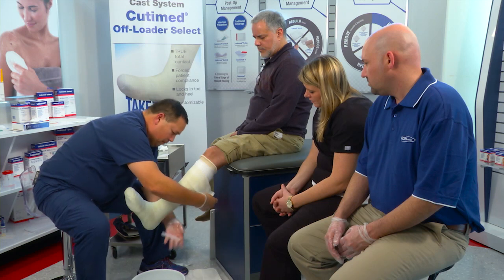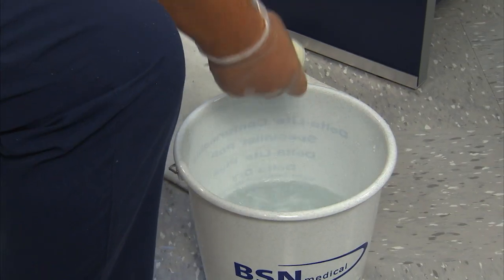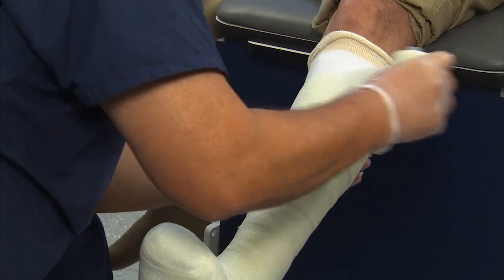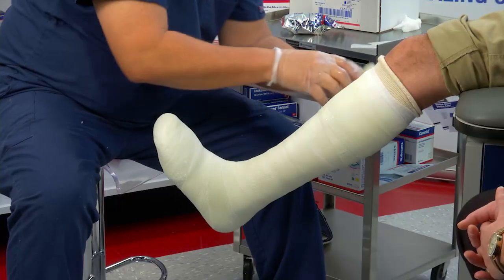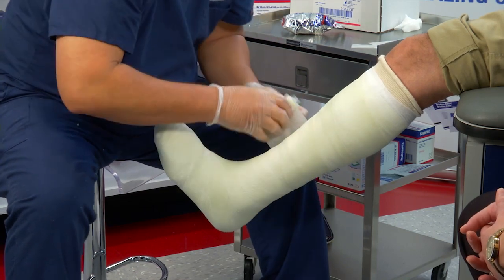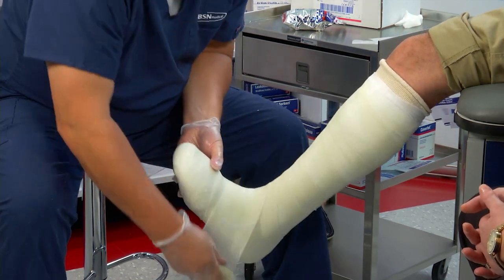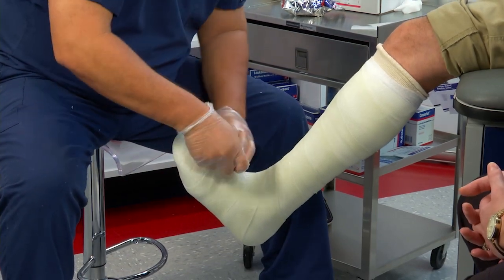This third layer, I'm going to start where this roll ended and roll this one proximal to distal. Leave a little bit of a gap here at my marker, giving some tension with the barrel close to the body. No figure eight, keeping at 90 degrees, ending this tape right there.